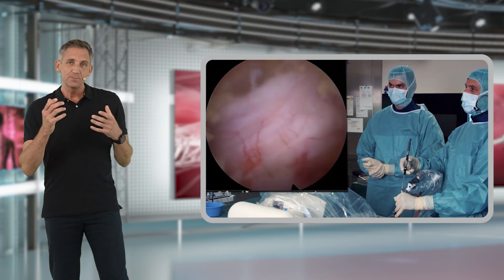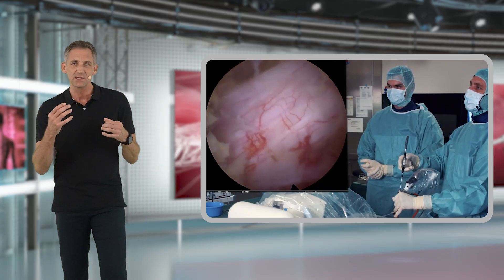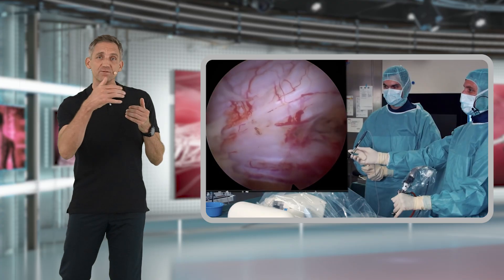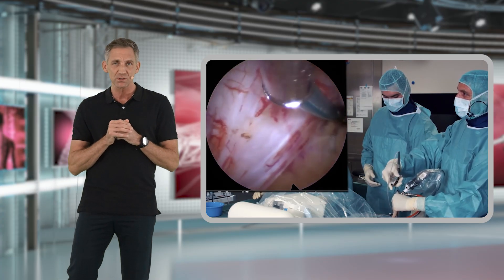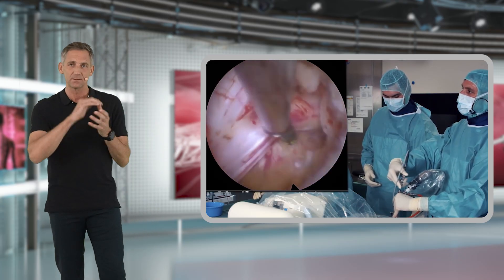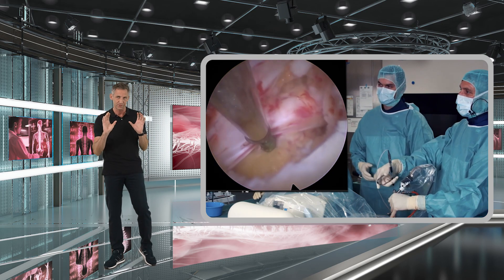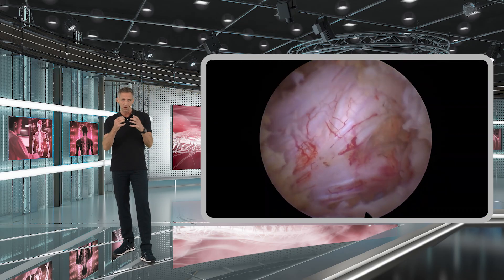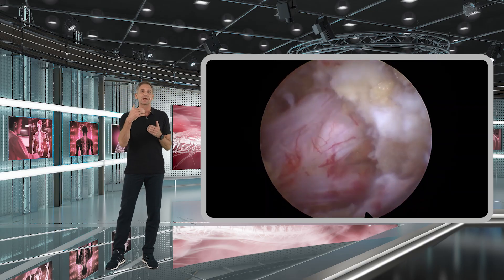You can distinguish between the two: the dura in structure is much softer, often shows pulsations, and may also be slightly pushed aside by the irrigation system — almost like a sail in the wind. You don't have that with a nerve root. In contrast, the nerve root is much stronger, much more rigid in structure, and in comparison almost like a cable.